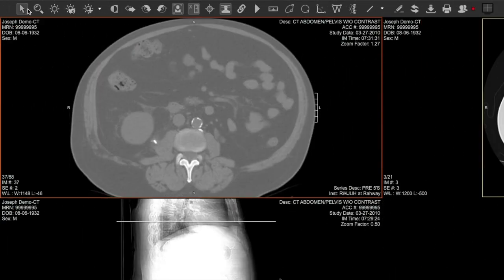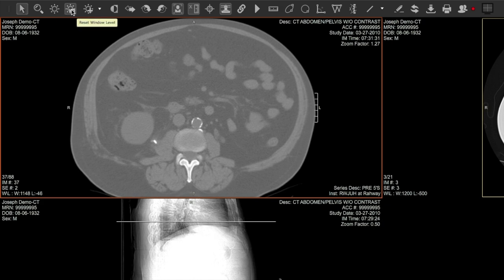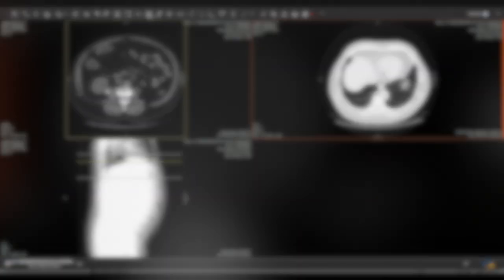Along the top of the viewer, you will find many image manipulation tools. Hover over each one to see a pop-up description of what it does. Although many of them are designed for physicians, don't worry about breaking anything — you can't. Nothing you do will be permanently saved in your record.